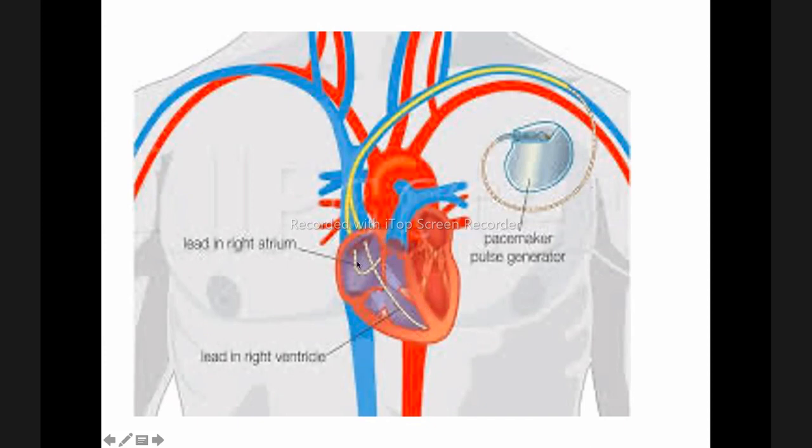You set the rate to a normal physiological rate. So you can even start off by putting it at 60 beats per minute. So it will start pacing at 60 per minute, okay? So it has taken over the function of the SA node, the His bundle and the bundle branches. It is now the one that is pacing the heart. So your heart rate will improve. And as long as it's being done in a synchronous manner like that, and you've done your settings very well, you'll be able to maintain a good cardiac output.